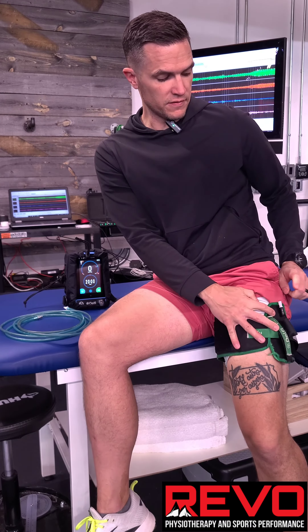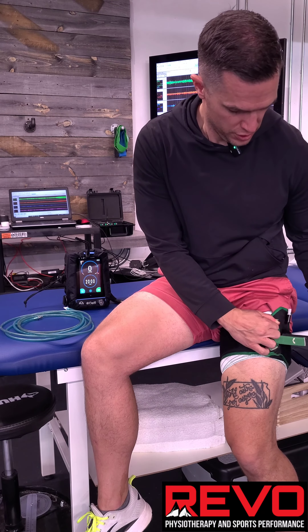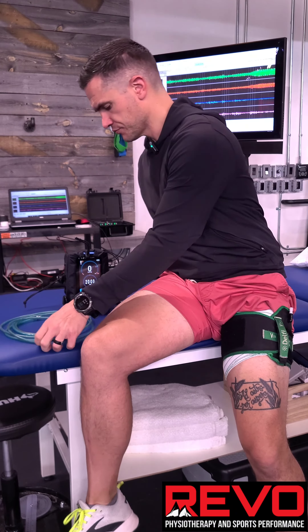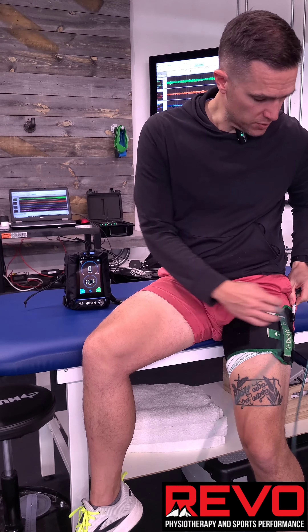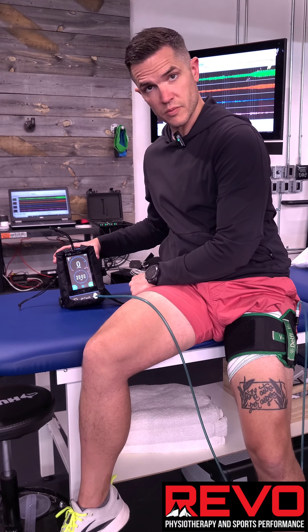Please note, the valve always goes on the outside of the leg. Pull it through — should be pretty snug. I want that white strip going underneath this little loop here. Plastic to plastic, metal to metal.